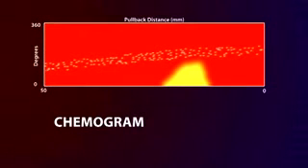The algorithm will be trained to indicate the probability of lipid-rich plaque at each pixel, and a chemogram will be generated. When the algorithm research is concluded, the chemogram will provide a detailed map of the presence or absence of lipid-rich plaque in the arterial segment that was examined.